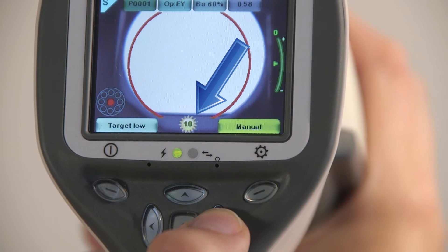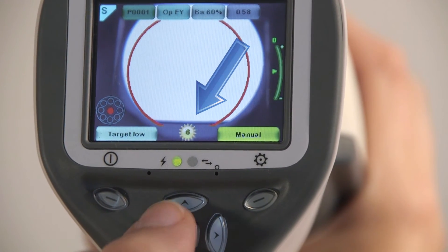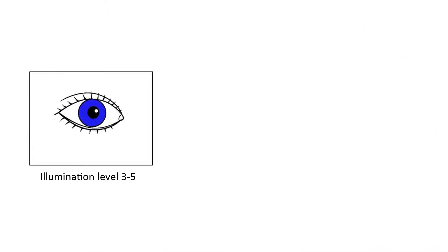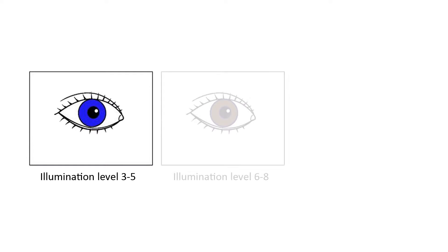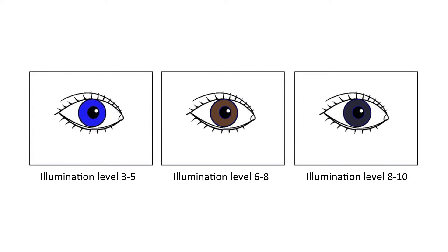Select the right illumination level by pressing the left and right arrow keys. There are altogether 10 brightness levels with a default value of 5. Suitable illumination for a person with blue eyes is typically 3–5, for brown eyes typically 6–8, and for very dark eyes 8–10.